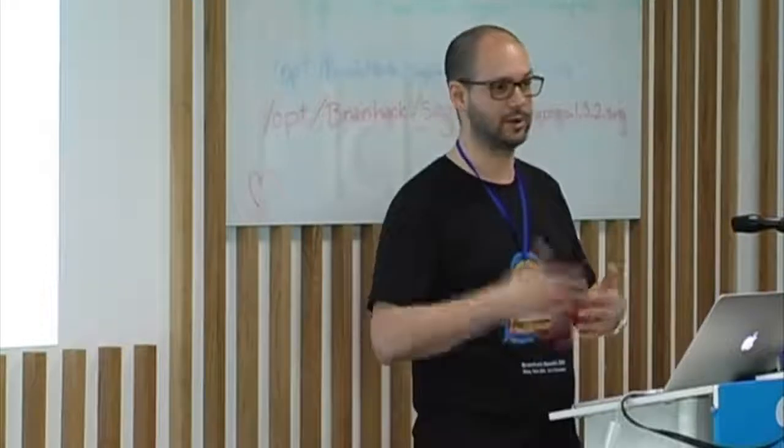Typically, the probabilities decay with the streamline length. So let's say you're interested in tracking the fibers that run from the posterior to the anterior part of your brain. They need to travel quite a long distance. Given the noise in your measurement, they will go through areas which have different degrees of uncertainty, high, low, and so on. So you're going to get very low probability weights between the posterior and anterior part of your brain, but these just reflect the noise in your data set. They don't reflect any neuroanatomically grounded concept of structural connectivity between the two areas.